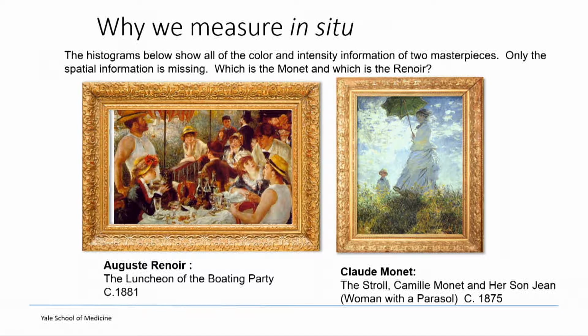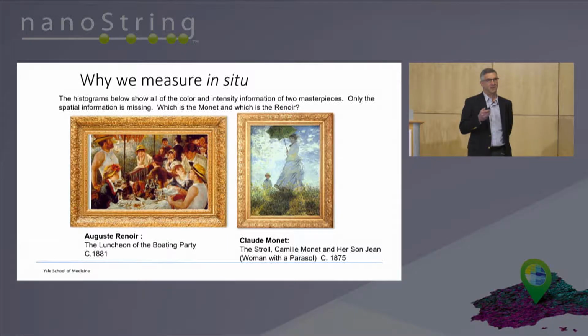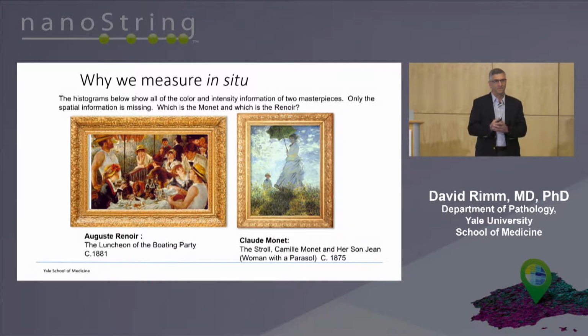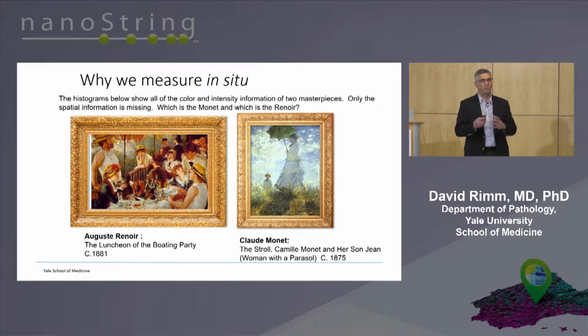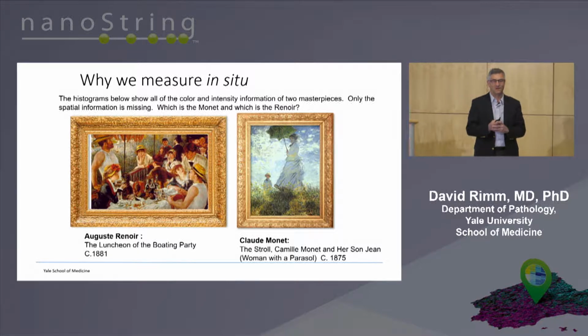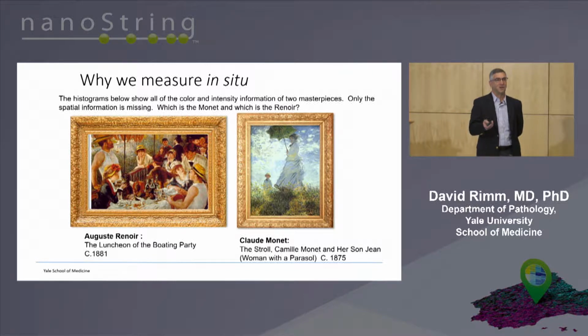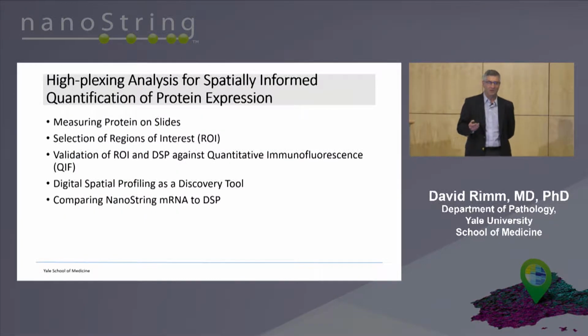And that's the critical information that's spatial that we're ignoring when we grind things up or do the sort of fruit smoothie analysis that was given by the previous speaker. Or even if you line up all your blueberries and cherries, you still don't get this kind of information. That is the spatial information, where things are with respect to each other. I think that is absolutely critical. So that's what I want to talk about.